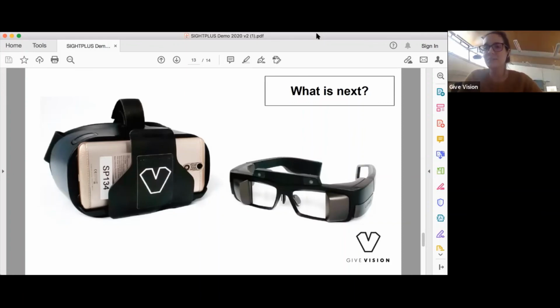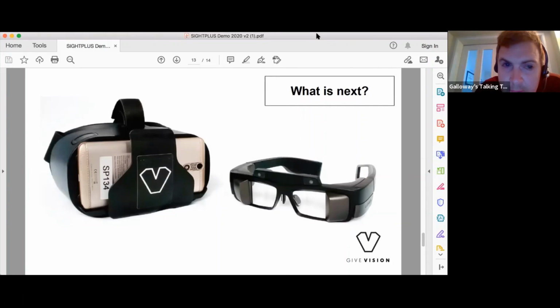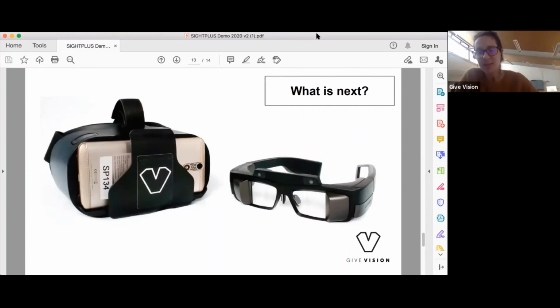Basically it's like having a fancy camera on your face. Mark, our Facebook friend, was saying that it's like having your phone on your face. You might be able to scroll in your phone menu and mostly take pictures. I'm sure you can do a lot of things, but you won't necessarily be able to do what we are doing, processing the image in real time and adding filters so it matches people's needs with zoom and contrast and so on. It's mostly having your phone menu on your face.